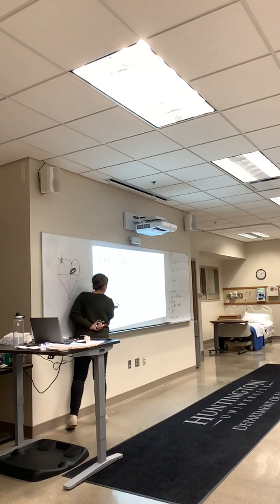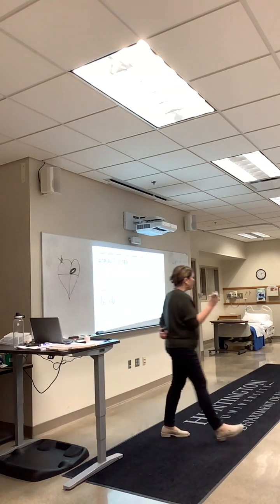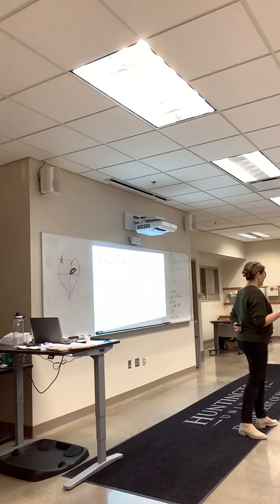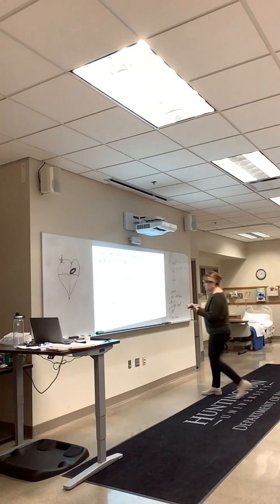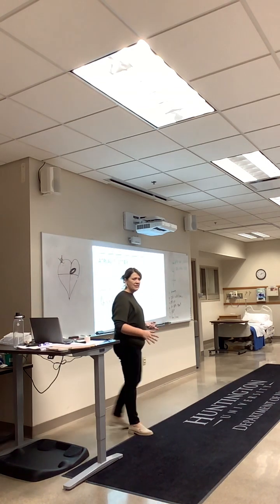Oh, that's a signal through. Again, again, again. But it's from a single or a limited location. So it looks like a saw or waves. It looks like a sawtooth type thing that's going through there. Does that make sense? What's the difference between flutter and fib?